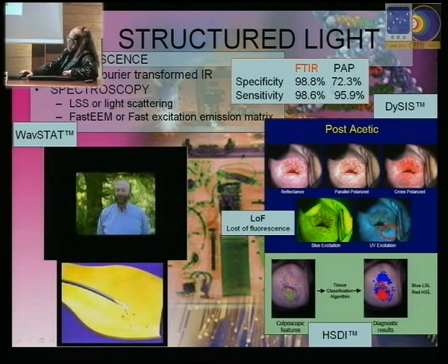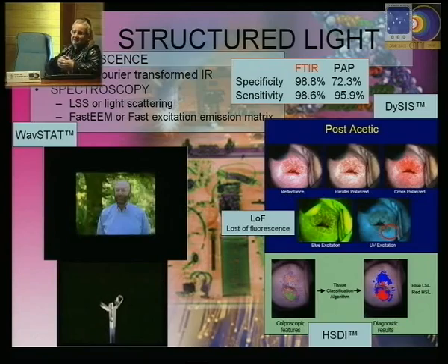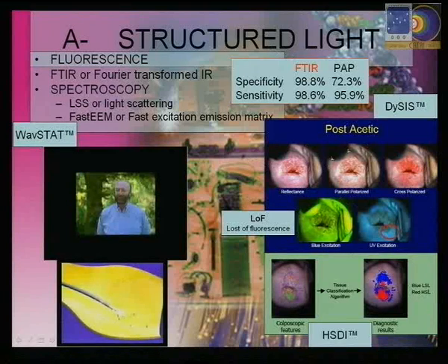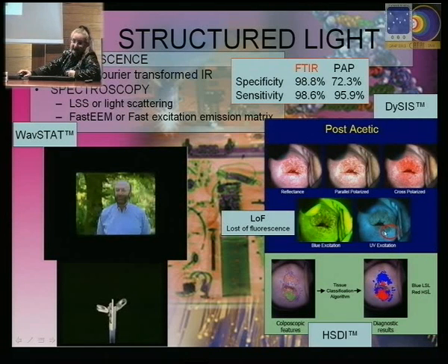gastrointestinal area. You can see from the image that the details you get are different from one excitation light to another. And sometimes they tune all the excitation lines from one length of light to another, or they automatically select, as we will see, specific excitation lines according to the tissue or the pathology you are seeing. The most interesting thing in here is that, as you can see, when you have a loss of fluorescence, this area could be malignant.